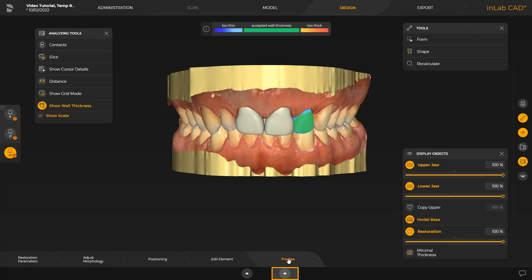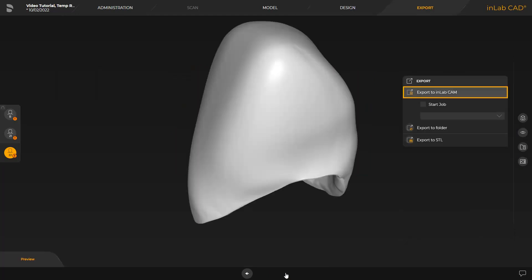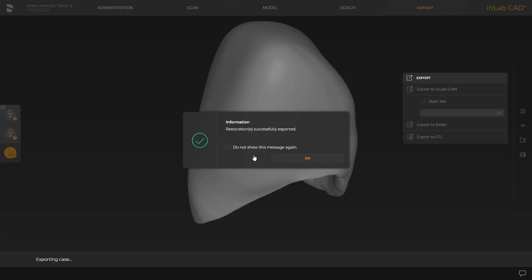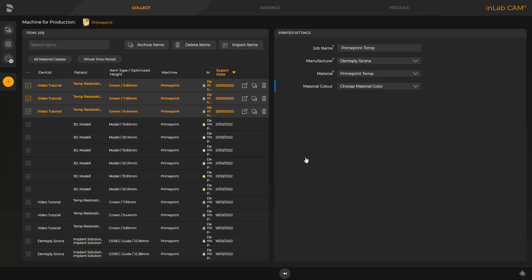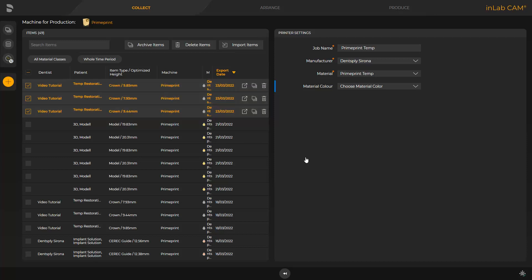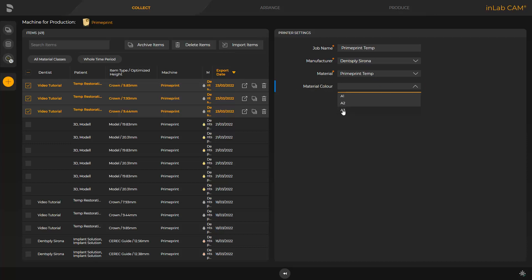In this case, we will proceed with exporting the data. By tapping Export to InLab CAM, the restoration data will be transmitted. We confirm with yes so that all restorations will be exported, and a subsequent message confirms successful data transmission. After the InLab CAM software is opened, all cases previously transmitted are displayed. The restorations we just exported are already selected and we determine the material color under printer settings. Here we can either select the so-called fast track by tapping the double arrow or we can switch to the next phase, the arrange phase.